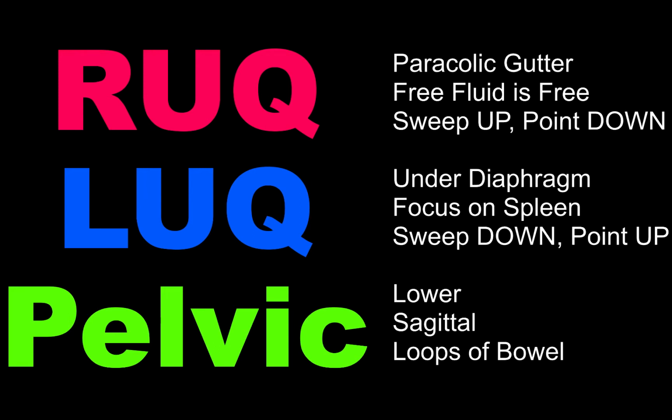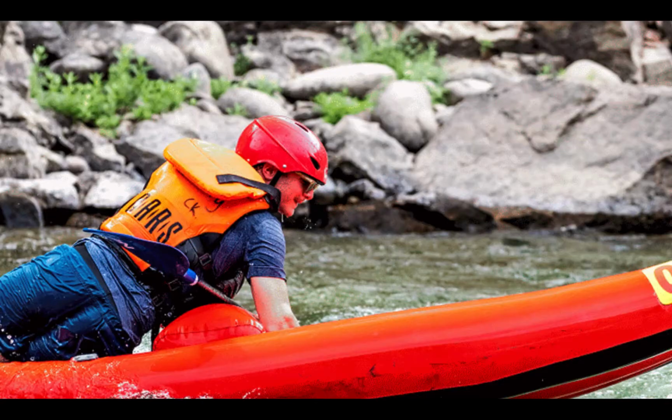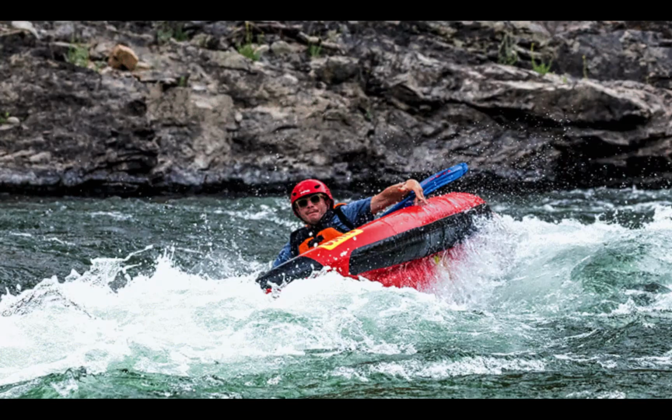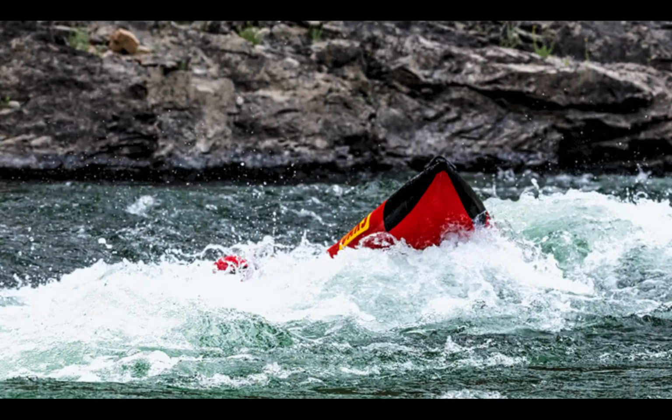Alright, at this point, you might feel kind of like me getting swept under this rapid of free fluid, but bear with me for a few more minutes because there is one more spot that you should be able to recognize as having free fluid.